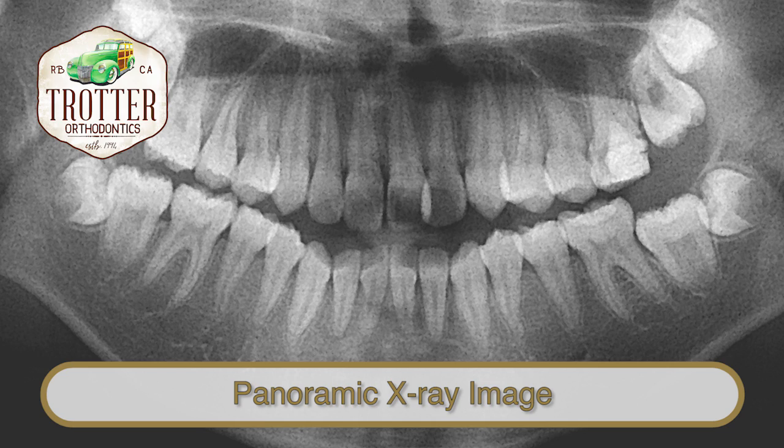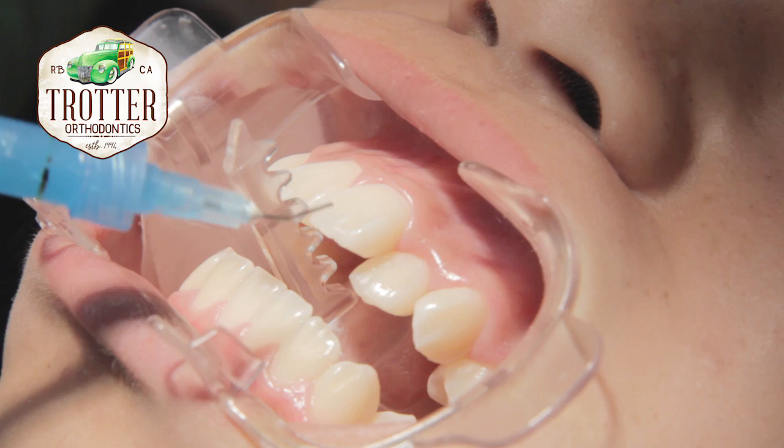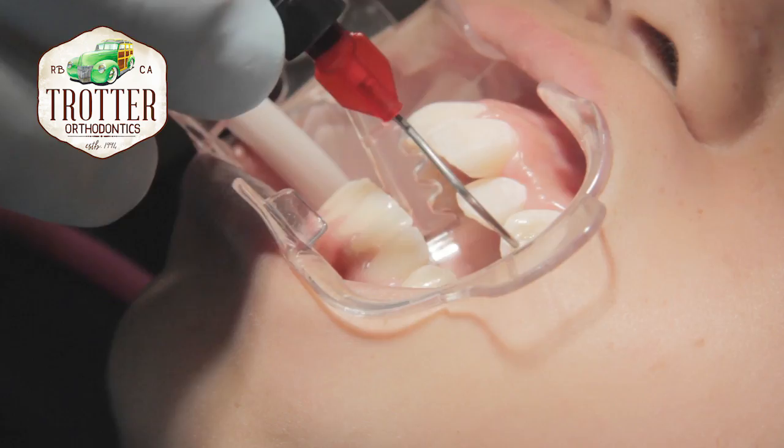To place the brackets, the surface of the teeth is cleaned with a cleaning agent and then rinsed off. Once they are cleaned and isolated, an etching solution is applied to the surface of the teeth to roughen the surface and increase the bonding strength of the glue. The etching solution is rinsed off, then a sealant is placed over the teeth and dried to allow the glue to adhere properly.